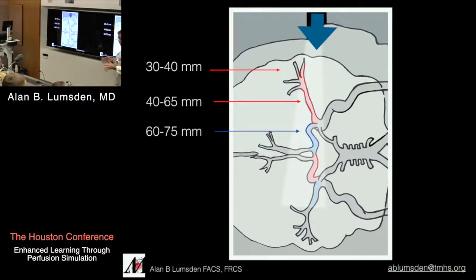So let's take it to the point now where the surgeon puts the cross clamp on. There's no embolization. We've criticized it because it's too sensitive. You've done the procedure that is probably most likely associated with embolization, but there's no emboli. I'm telling you, the stroke did not happen during that phase of the operation. It's something else that you have to look at. So if there is no embolization during cannulation, decannulation, whatever he's actually doing, it didn't happen then. Look at the part that has a lot of embolization. It doesn't mean that's when it happened, but at least you start narrowing the operation down to a point that you can work with.